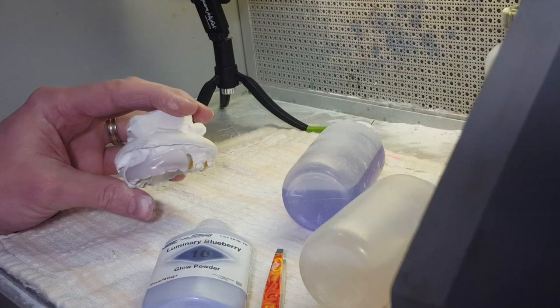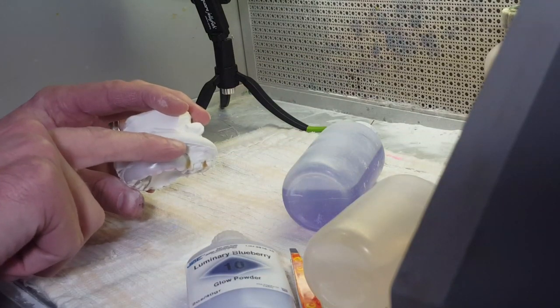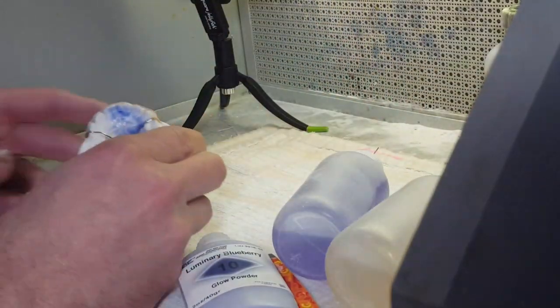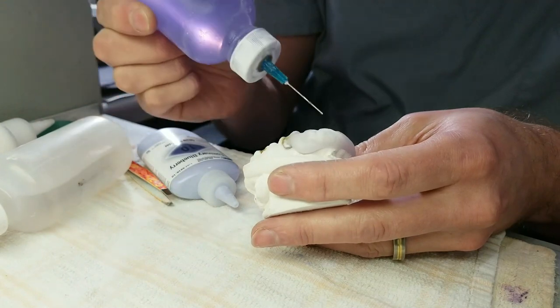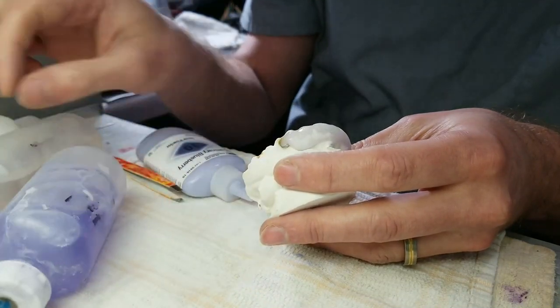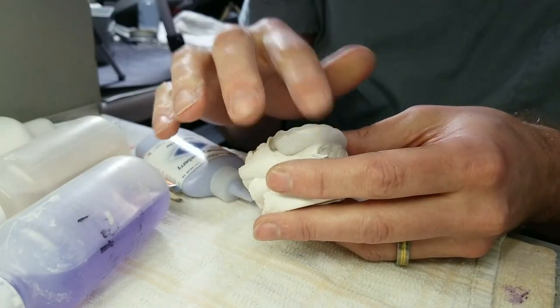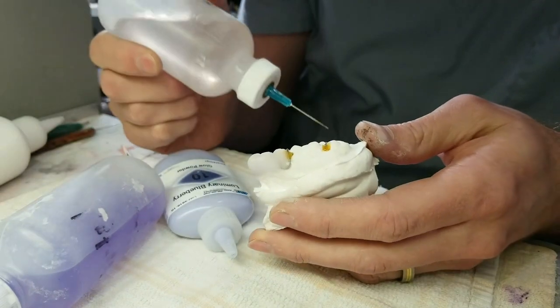I got distracted and it slumped on me — so I'm letting gravity do the job and pull it back down. I might be able to help with my finger. You've got to pay attention to your acrylic. That sucker slumped like crazy, so I'm going to cut off that excess later. I did get some to slide back down. I'm going to leave a coat of powder on there to keep it from slumping. Back to the inside.